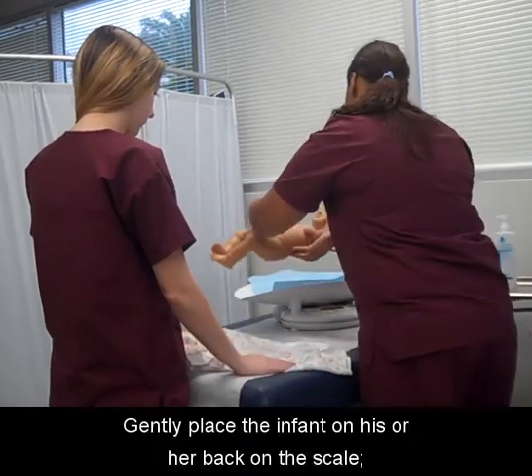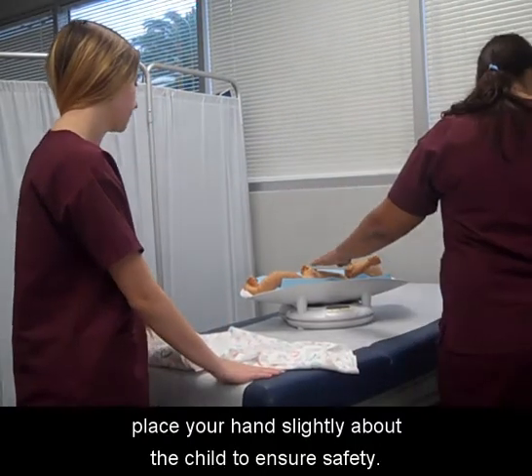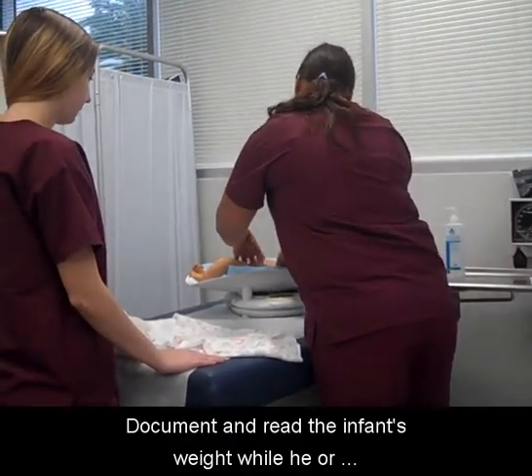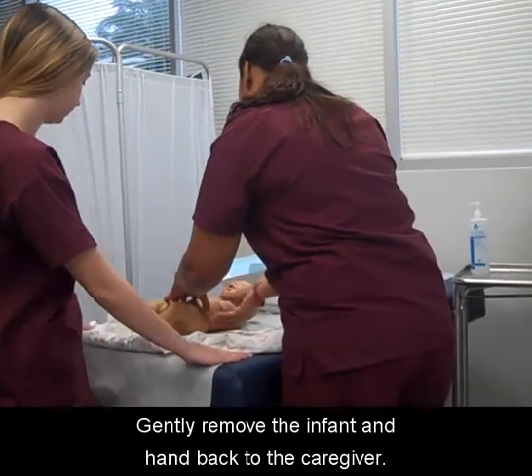Gently place the infant on his or her back on the scale. Place your hand slightly above the child to ensure safety. Document and read the infant's weight while he or she is lying still. Gently remove the infant and hand back to the caregiver.